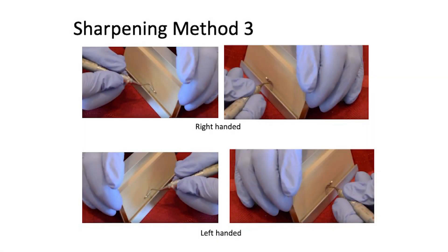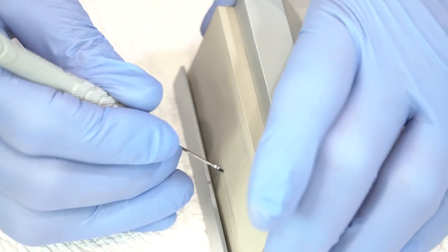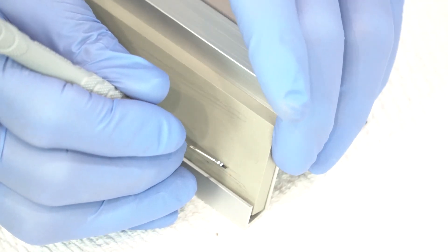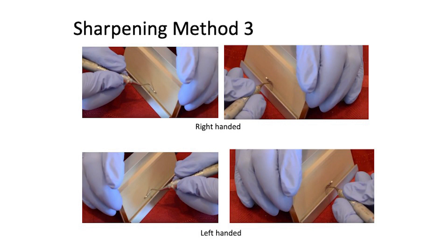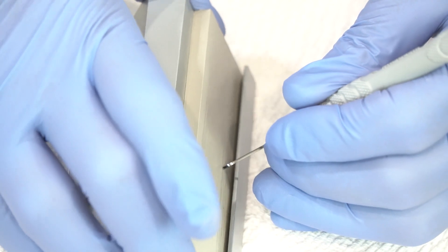The last method, method three, is one where you fulcrum up on the table, hold the instrument firmly with the face parallel to the tabletop. Start at the heel third, the middle third, the toe third, and the toe. With this technique, you're moving the entire fixture around the curvature of the blade. With the left hand, start at the heel third, the middle third, the toe third, and the toe.